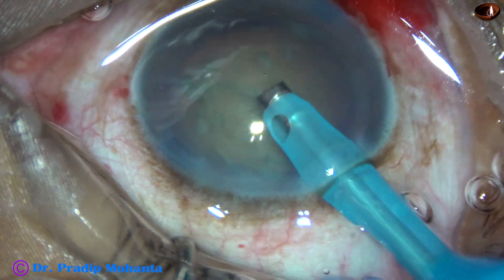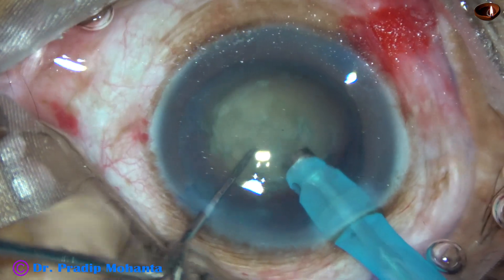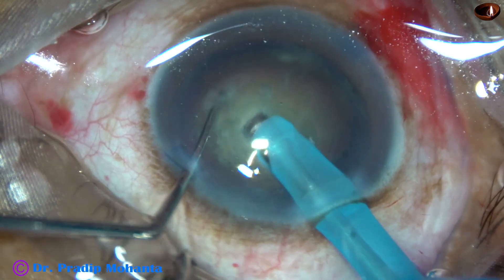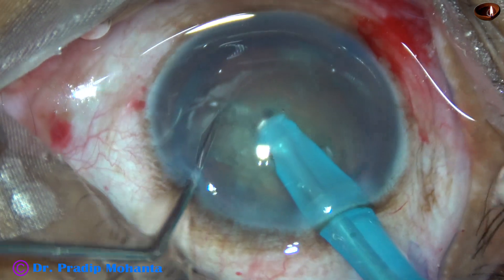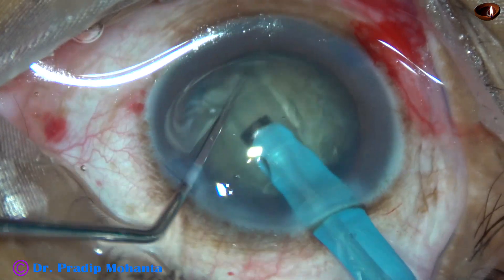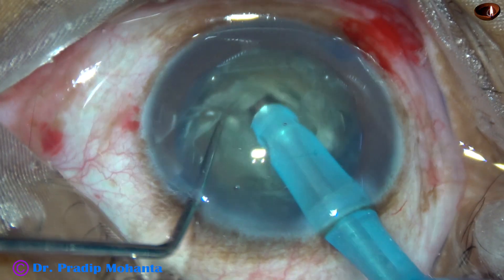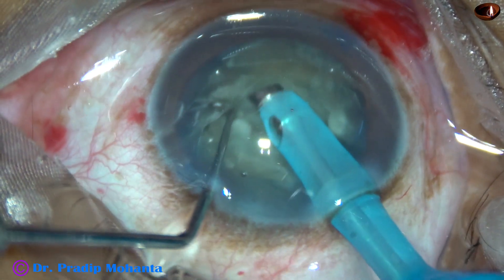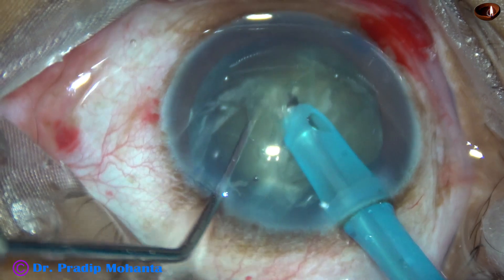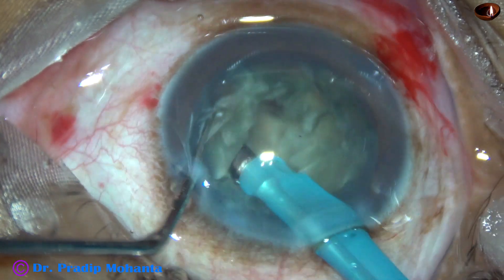Watch the layer of BSS over the cornea. I am doing what you can call underwater phaco. My assistant is soaking the layer of BSS as much as possible, but still there is a layer of fluid over the cornea. Underwater phaco is a nice term to describe this situation.